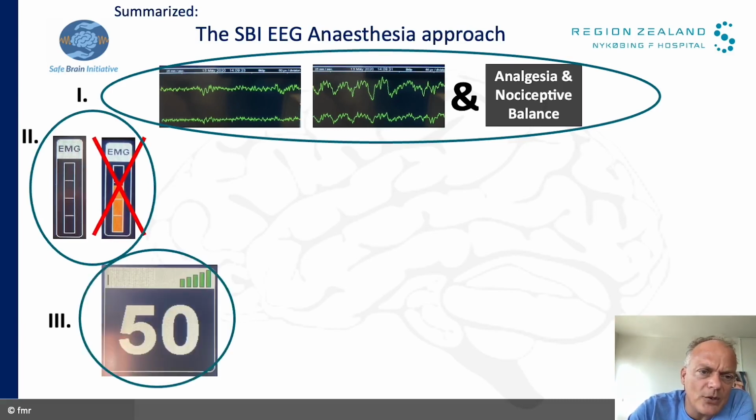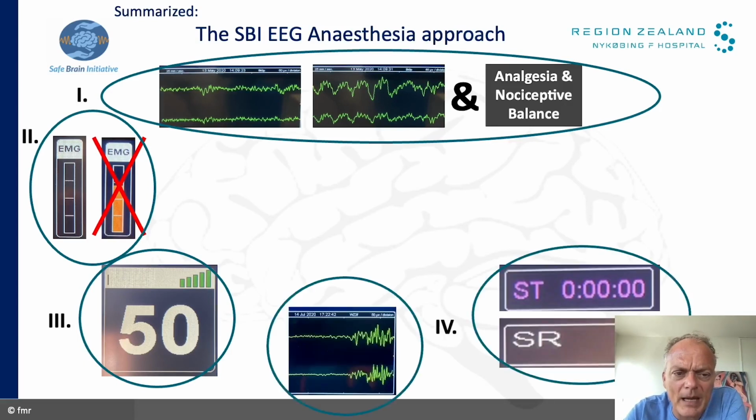Always cross-validate what you see in the EEG with your processed EEG number. The less experience you have, the better it is to have an additional number for backup. If you have produced burst suppression, again, it is easily recognizable in the raw EEG, but also to be seen in the suppression ratio, and in the suppression time over the whole period. Then you need to lighten up on the sedative part. Again, make sure that your analgesic is adequately in place.